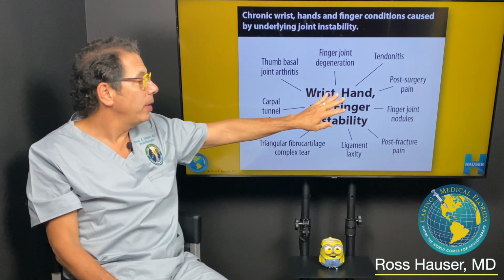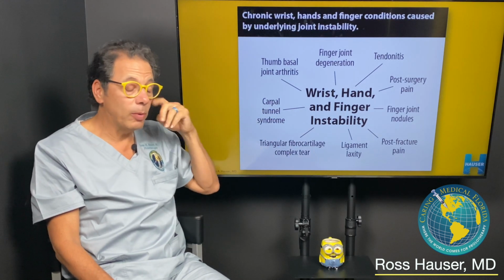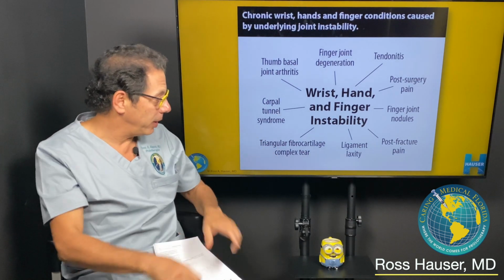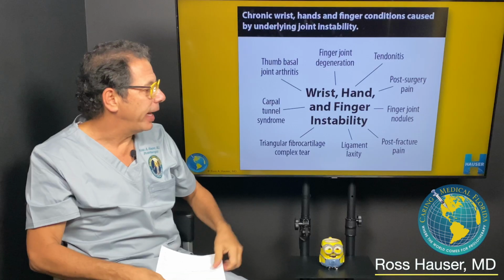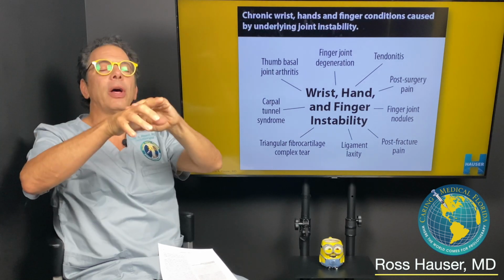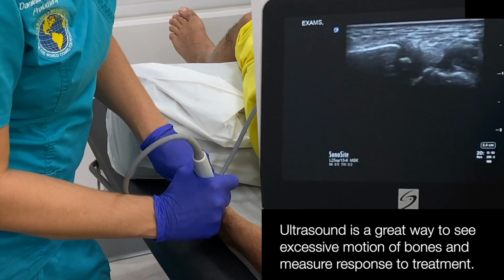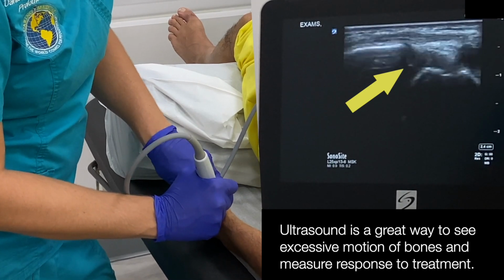Now, thumb, finger, wrist instability can cause all kinds of things such as carpal tunnel syndrome or median nerve irritation, triangular fibrocartilage complex tear, that would be here. When someone has a fracture, it injures the ligament, so post-fracture pain is mostly finger, wrist, or hand instability. Heberden's and Bouchard's nodules, that's from, in my opinion, instability, and we can show instability in the thumb or the finger by ultrasound. So we actually move the joint, and under ultrasound you can see the joint go apart, so that's a sign that you have joint instability.